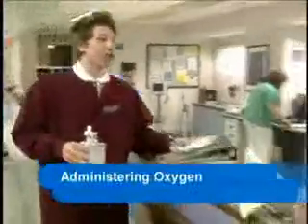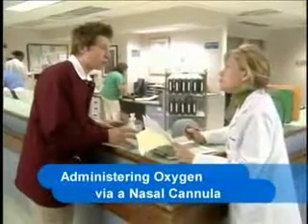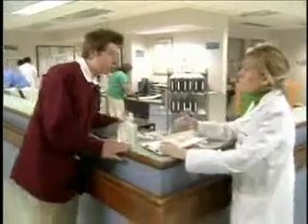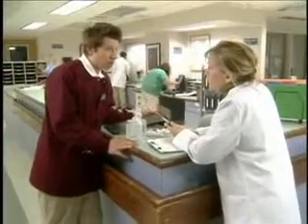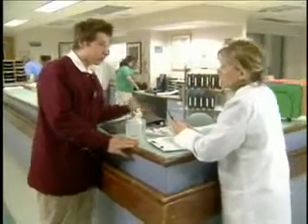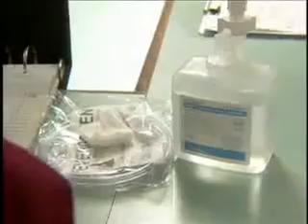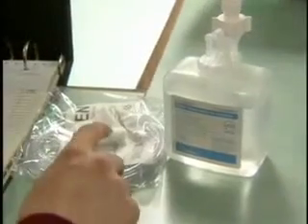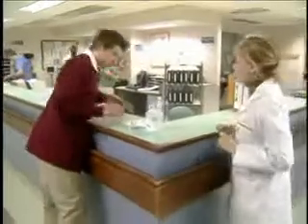Miss Lewis, I checked my patient's oxygen saturation level, and she had a reading of 91%. She was short of breath, and her nurse consulted the patient's physician, and she ordered oxygen. At what rate? 4 liters per minute. Will you come and help me set it up? Sure. Just check the physician's order and make sure that you've got all your supplies. Okay, we're good. Let's go.